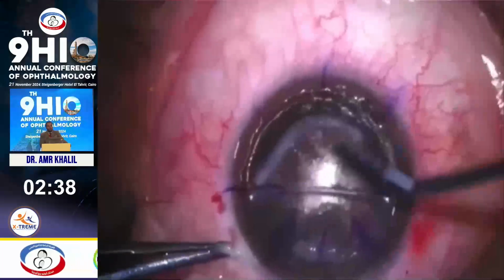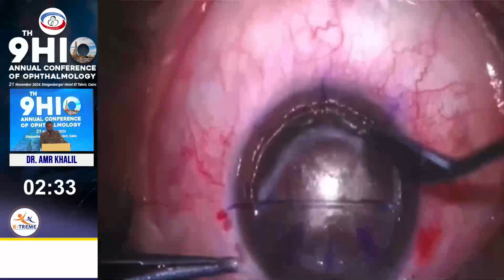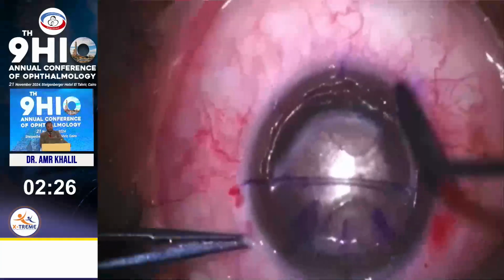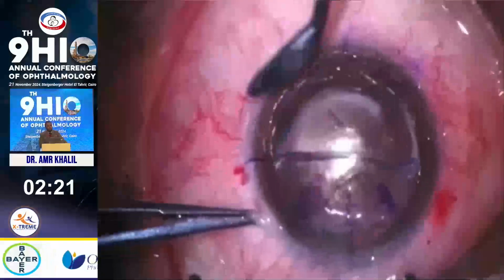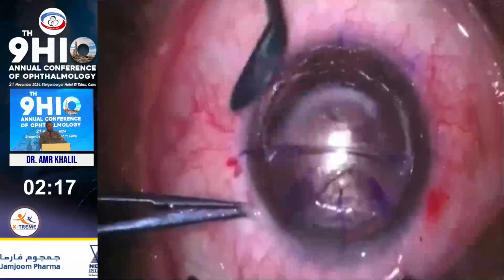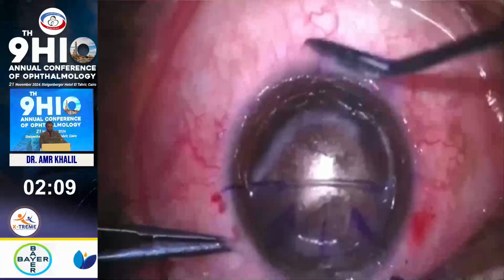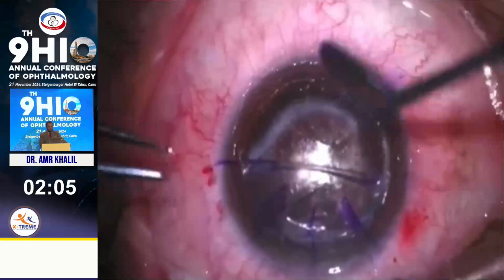As you see at the stromal bed, there are significant epithelial cells. Using a Hockey knife, I am trying to scrape the stromal bed. Another important step here is to also scrape the intact epithelium from the edges, as this allows better adhesion of the flap postoperatively, so it decreases the chances of recurrence. Scrape carefully but aggressively enough to remove all the cells.